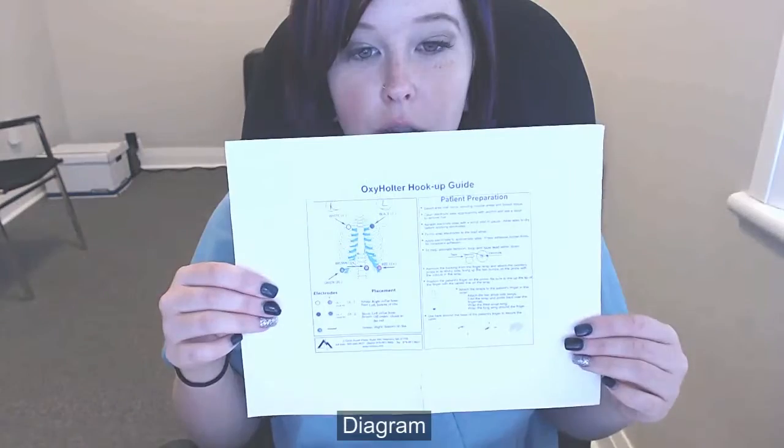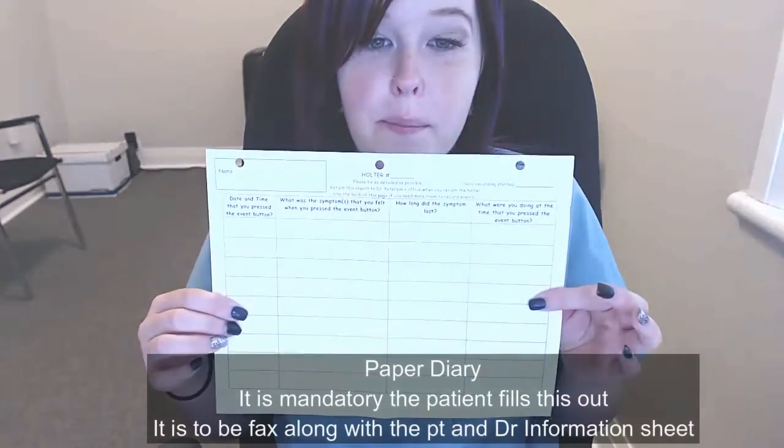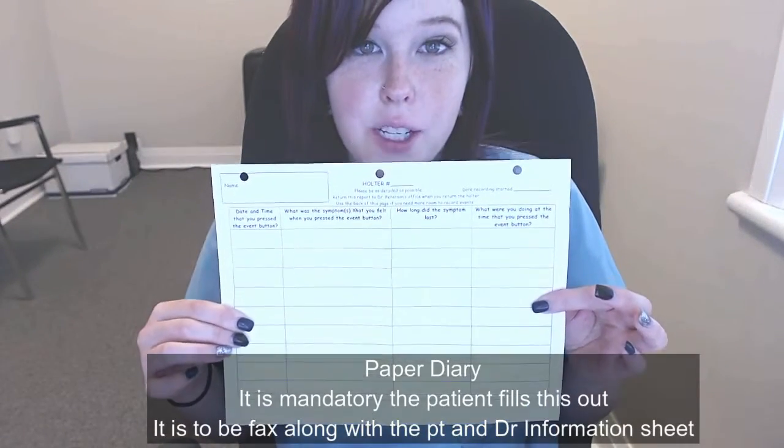The record agreement — do keep a copy for your office. In your kit, you're going to want to make sure you have the following papers: your diagram, overall instruction sheet, the event recording, and paper diary, which it is mandatory to fill out. You'll also need a minimum of two packages of electrodes.